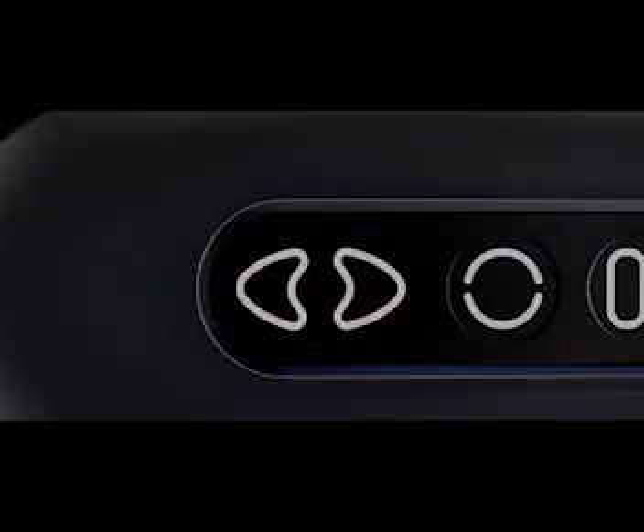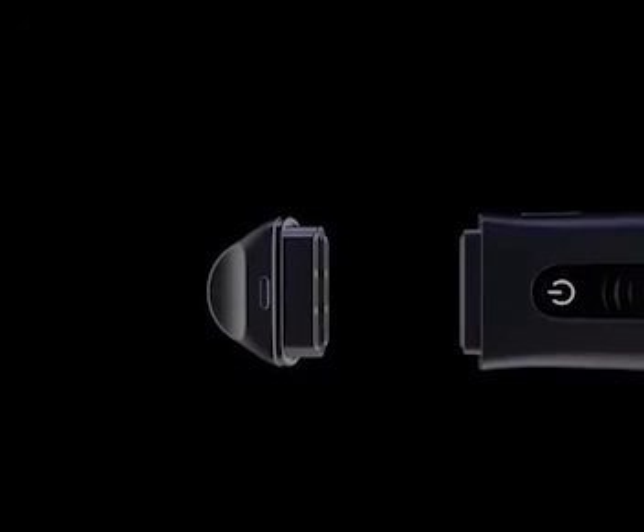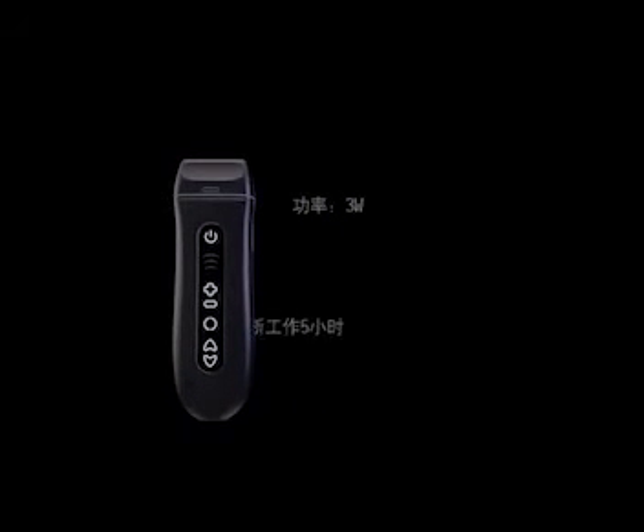Imagine an ultrasound system as small as your hand. The brand new U-Key Q7 weighs only 180 grams and is smaller than an average smartphone. With patented probe head swapping technology, the U-Key Q7 is able to scan any anatomical structure very easily.